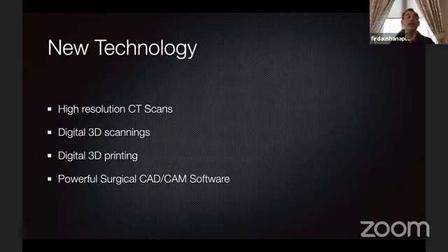The new technology means that you have high resolution CT scans, digital 3D scanning, digital 3D printing today, and powerful surgical CAD/CAM software that you can use to manipulate the surgery before you do the actual surgery.